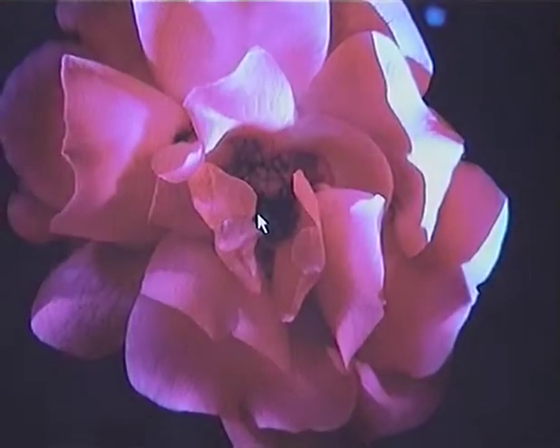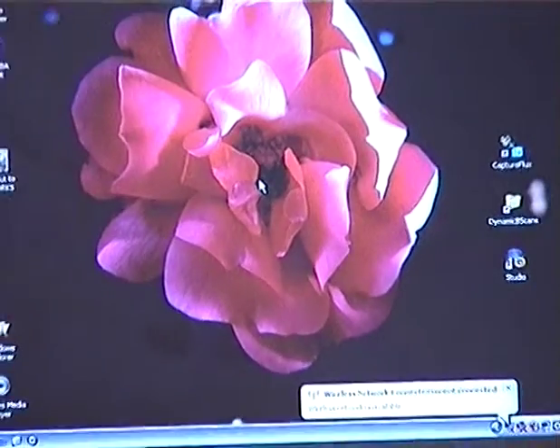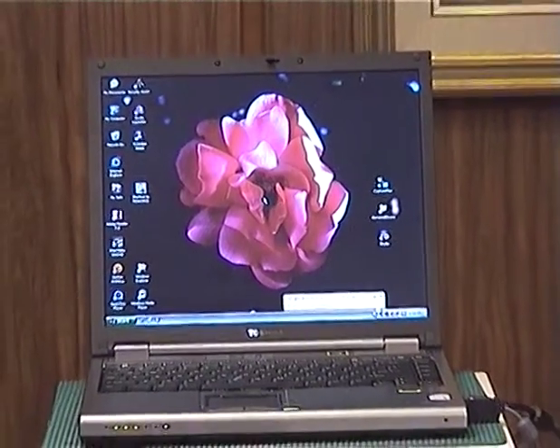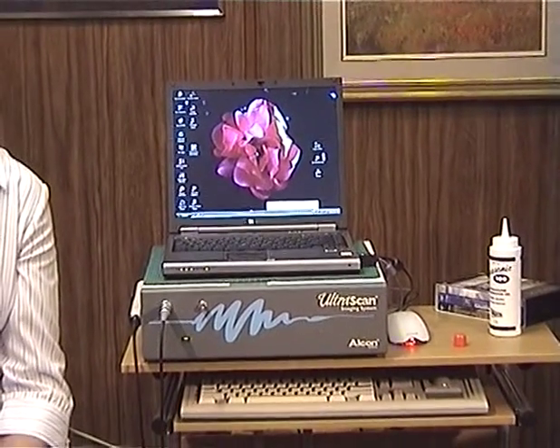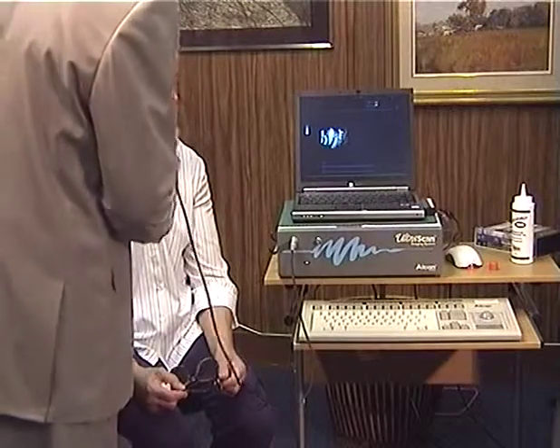The next advance came from the availability of laptops with DVD writing software. This is our current set-up, and all B-scans are recorded in dynamic, real-time on DVDs.